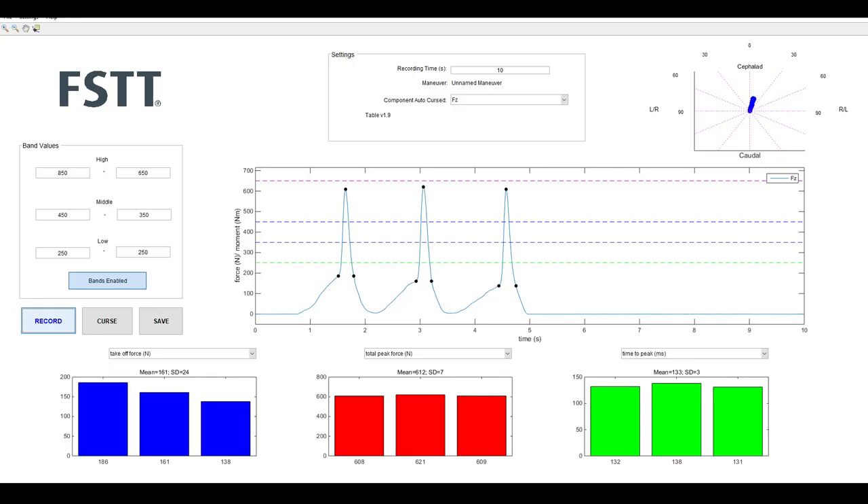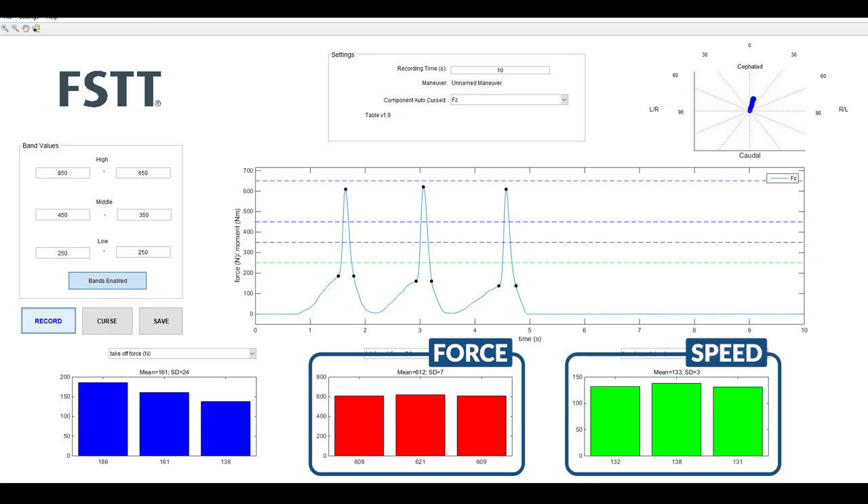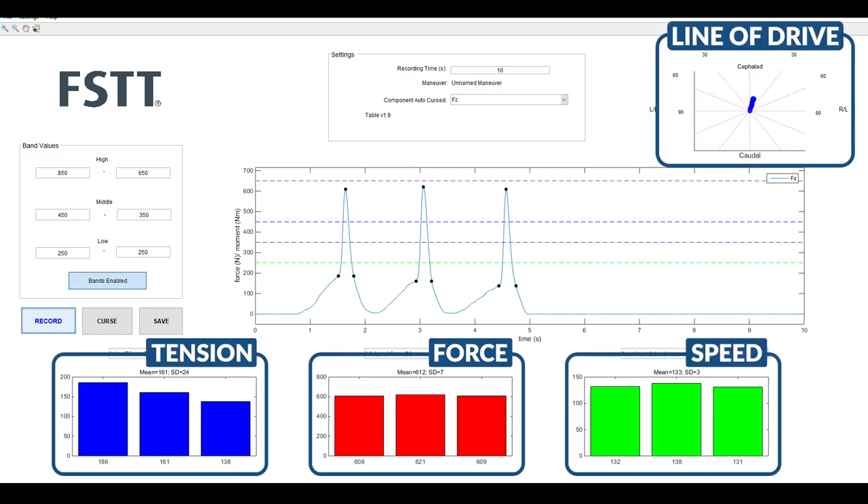Force sensing table technology is a set of tables that are able to measure quantitative data. It can measure force, speed, line of drive, the amount of tension that a student has, and actually show them in graphical form what they are doing.